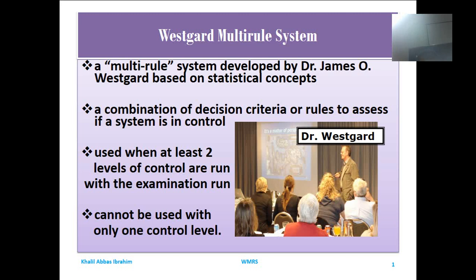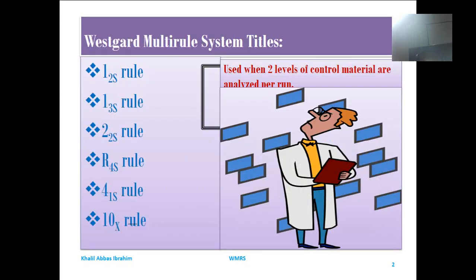Westgard rules are used when at least two levels of controls are run with the examination run. And Westgard rules cannot be used when only one control level is used. As we said before, that is unique to utilization with the Levy and Jennings chart. Westgard multi-rule system.